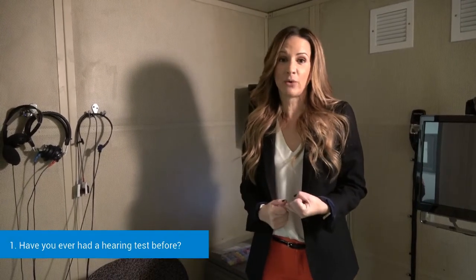The first couple of questions that we'll ask you are pertinent to have a better understanding of your hearing and what type of lifestyle you have. A couple of things that we'll ask you is, have you ever had a hearing test before, and how long ago was that? Any noise exposure, as in work related, or maybe you were in some type of the military, as well as tinnitus, or ringing or buzzing in the ears, so that way we have a better understanding before we test you.